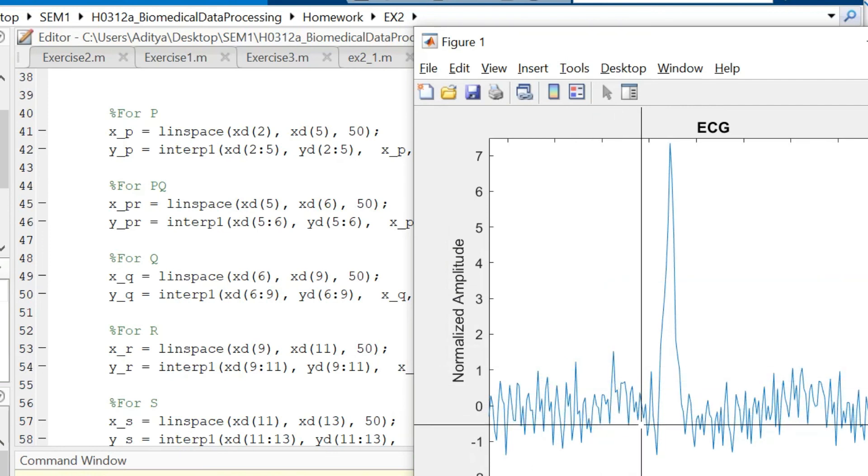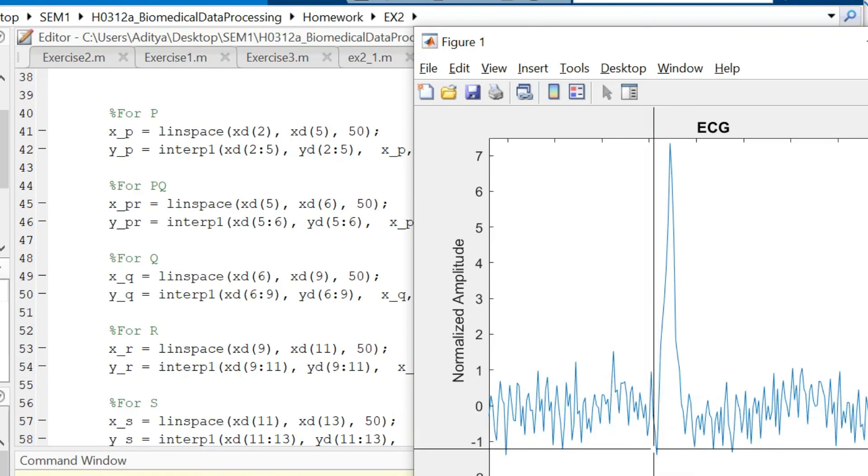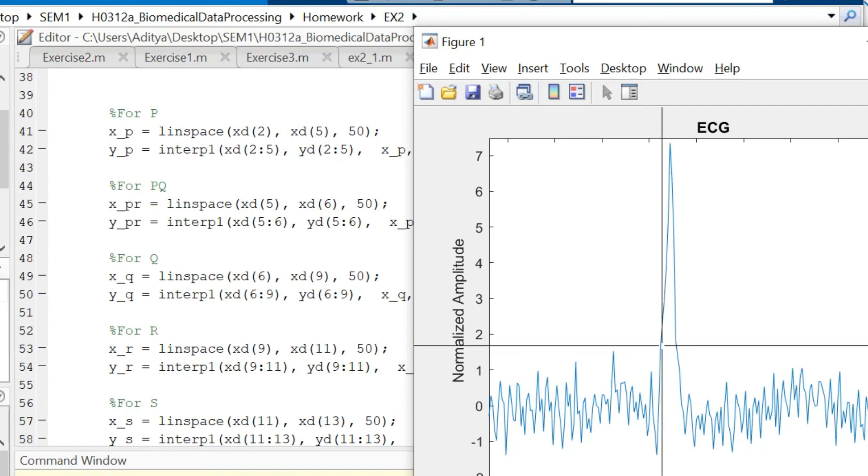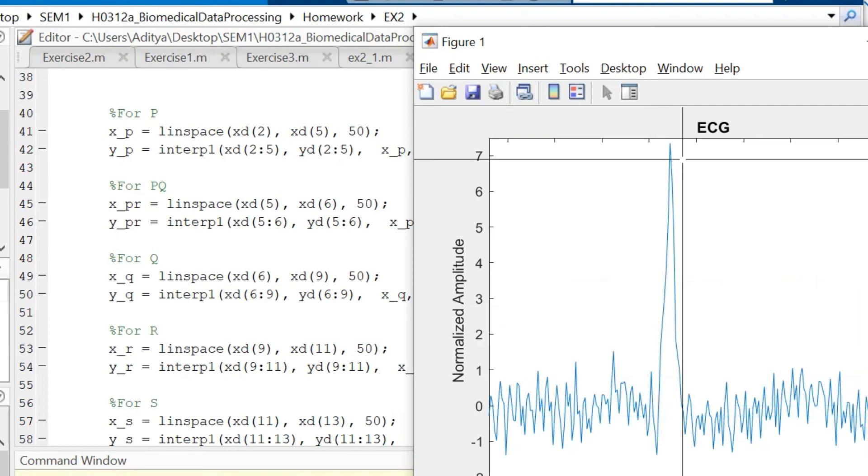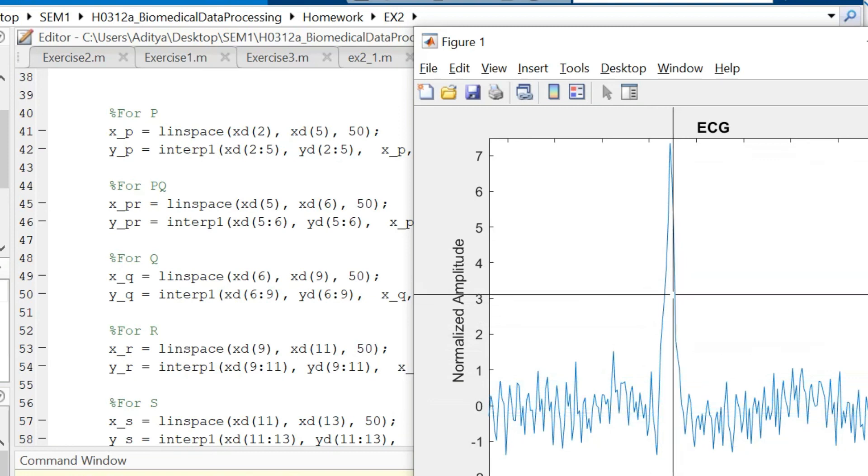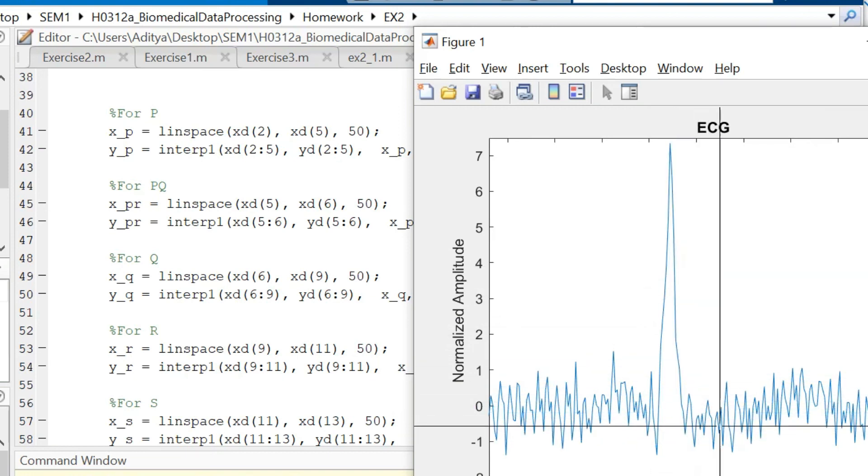Then from P to Q I have another point to be marked so I will mark another point in between. Similarly I will mark for Q, R, S, and T.